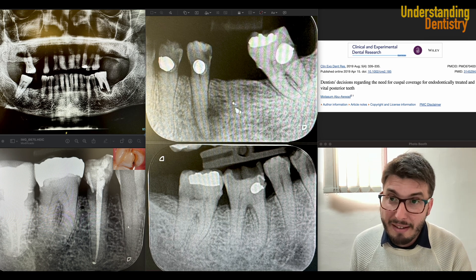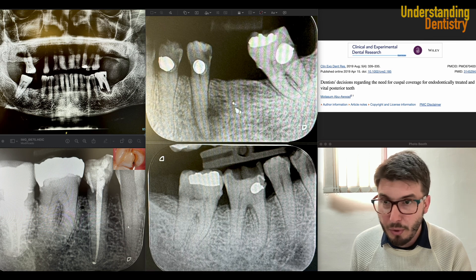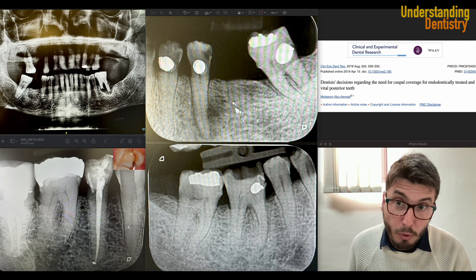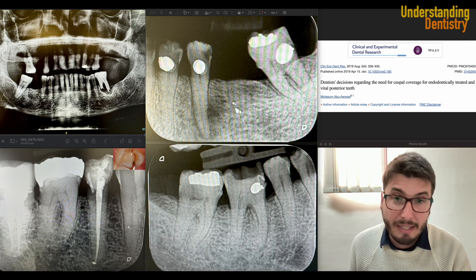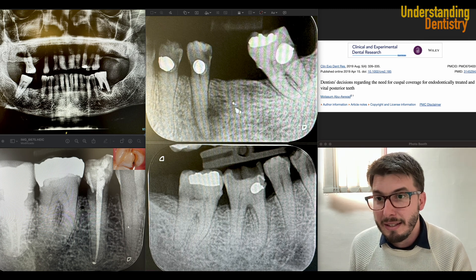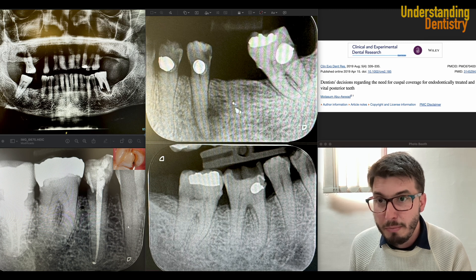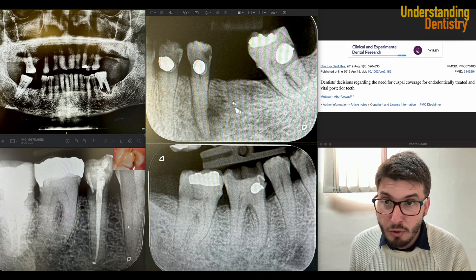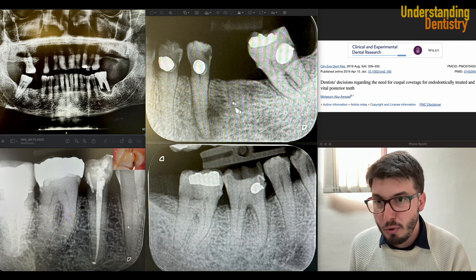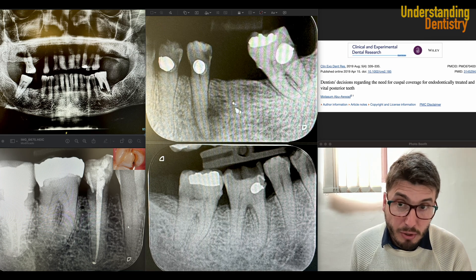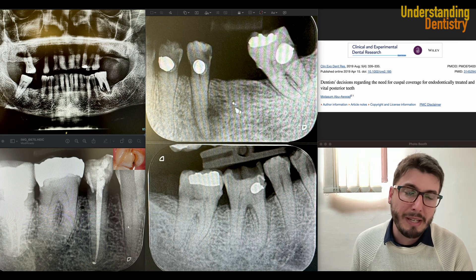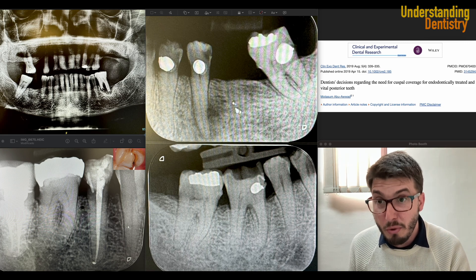For example, we have this tooth — the 3-6, the lower left first molar — indicated for extraction. It's indicated for extraction because we have the endo-perio lesion. It's not only a periapical lesion, but also the vertical bone defect associated and furcation exposure. There is basically no bone support for this tooth.